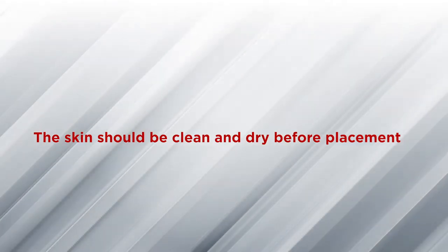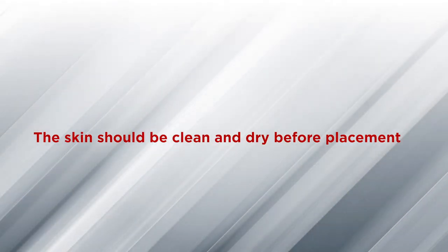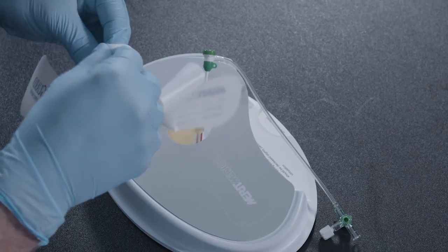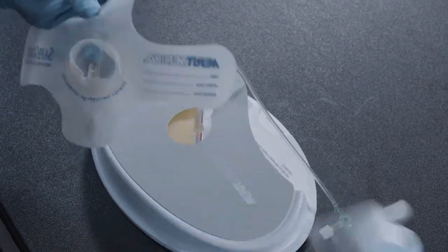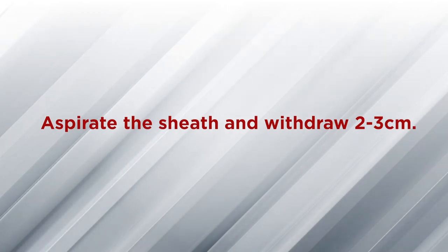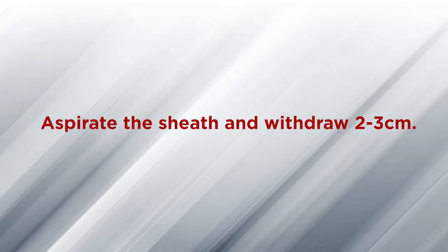Before you begin, the skin should be clean and dry. For the manual assist technique, with the sheath still in place, apply the Safeguard with the center of the balloon directly over the arteriotomy. Ensure that the inflation tube is in a location that is easily accessible to the clinician. Before applying the band to the groin, aspirate the sheath and withdraw the sheath back approximately two to three centimeters, ensuring the hub is outside of the band area.